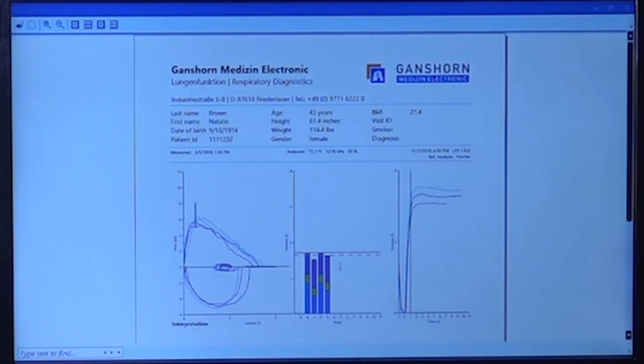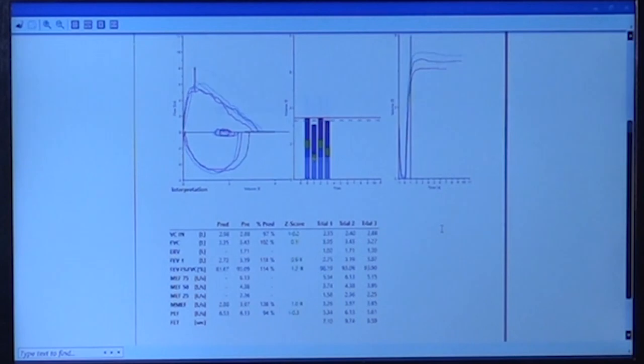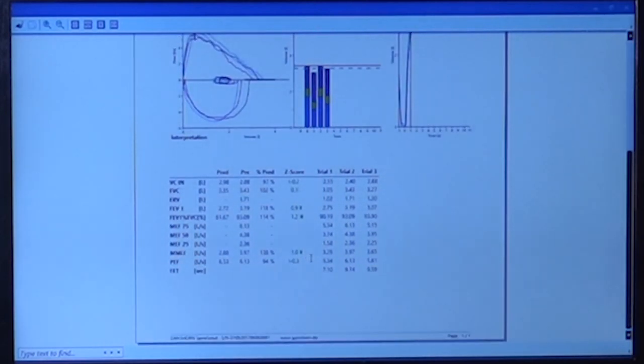So this is the Ganshorn LFX — one of the easiest and most versatile systems for spirometry in any kind of environment. Thank you.